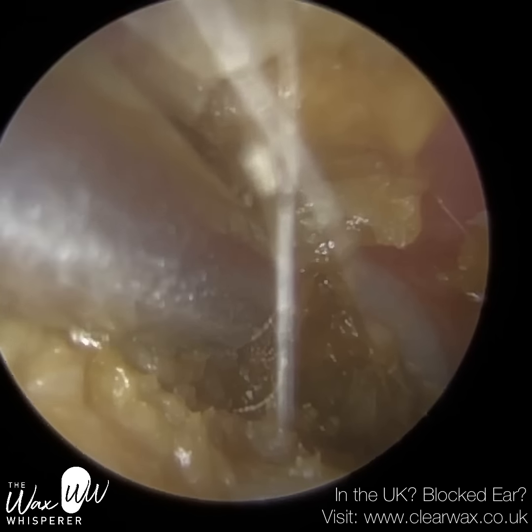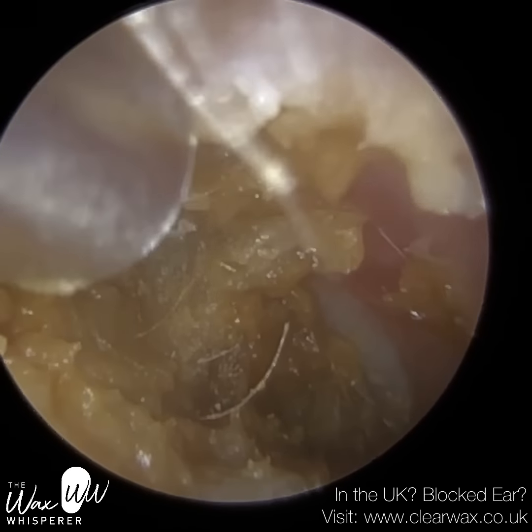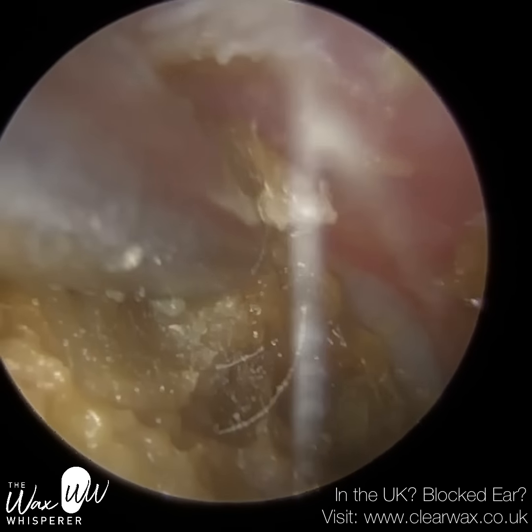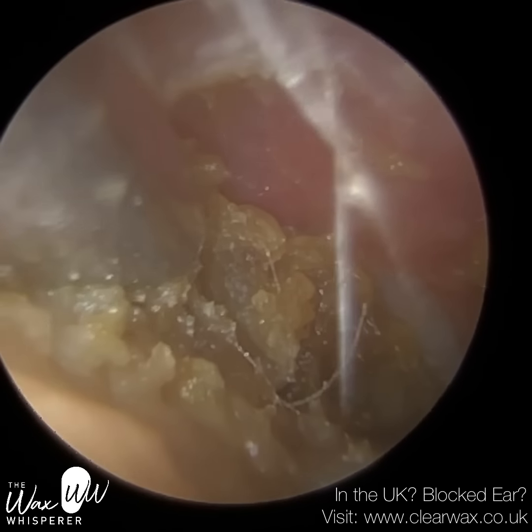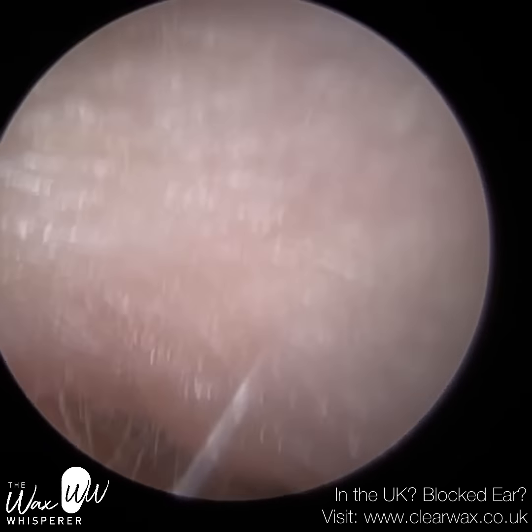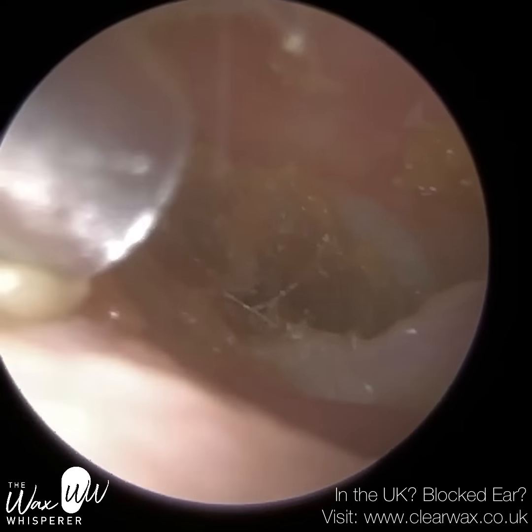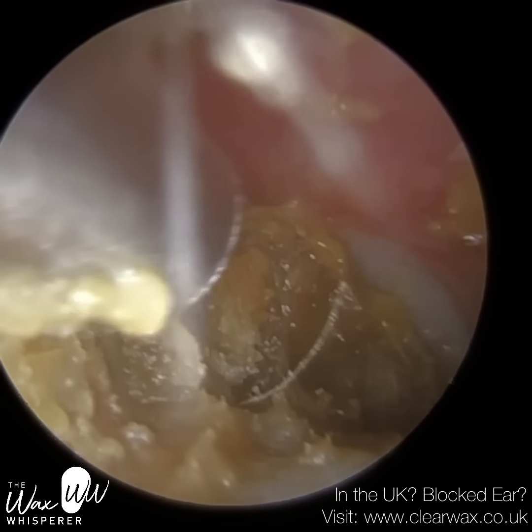I'm just working here at the roof of the ear canal. We've got to be careful because we are in the bony part of the ear canal now — the more sensitive inner two-thirds. I'm just gliding across the roof and coming our way downwards. You can see I'm managing to get that dead skin away. This is the front part of the ear canal — the region that's difficult to access because the ear's collapsed and very narrow. I'm using the endoscope almost like a doorstop: not only to visualise the earwax, but also to stretch and straighten the ear canal.